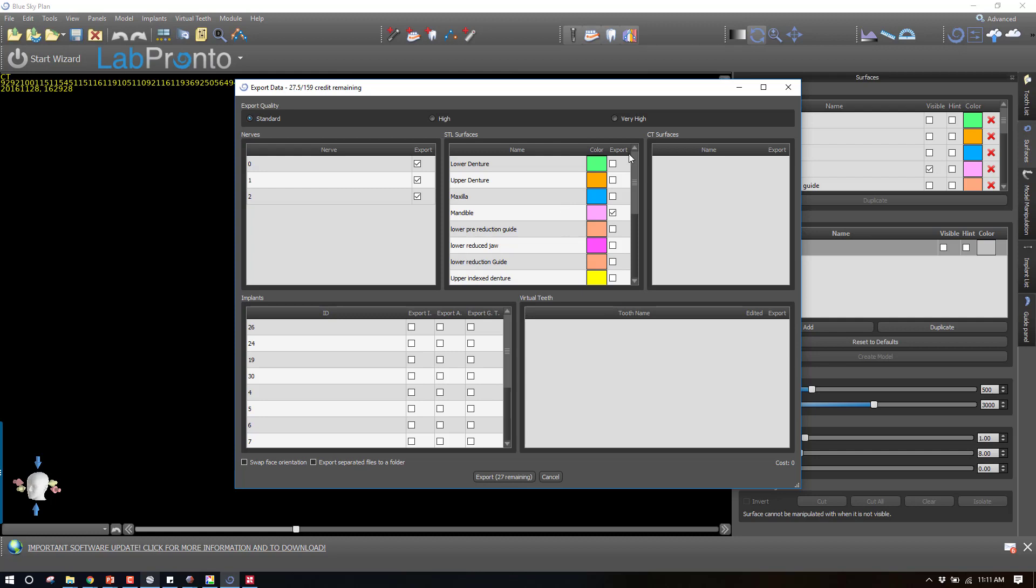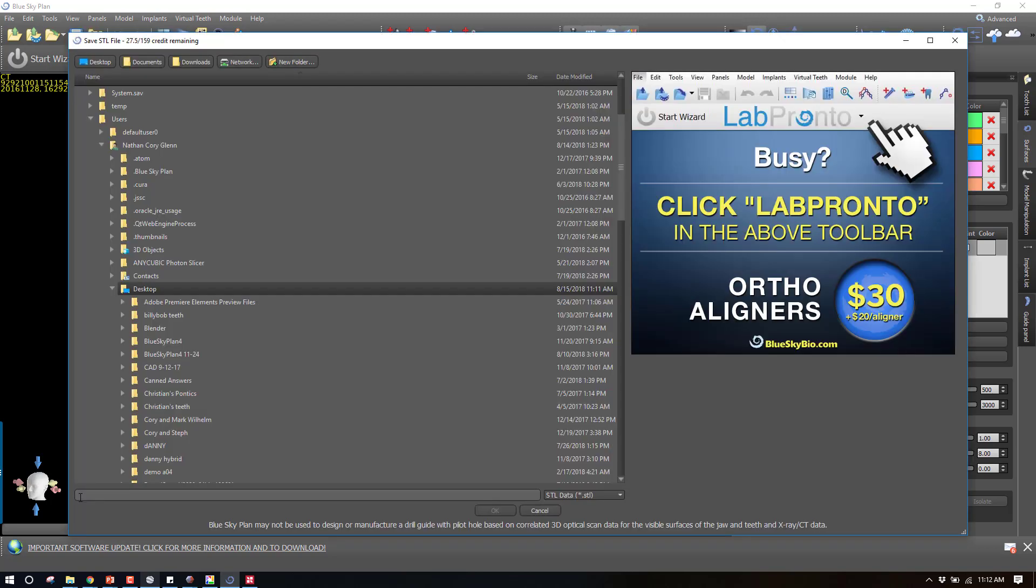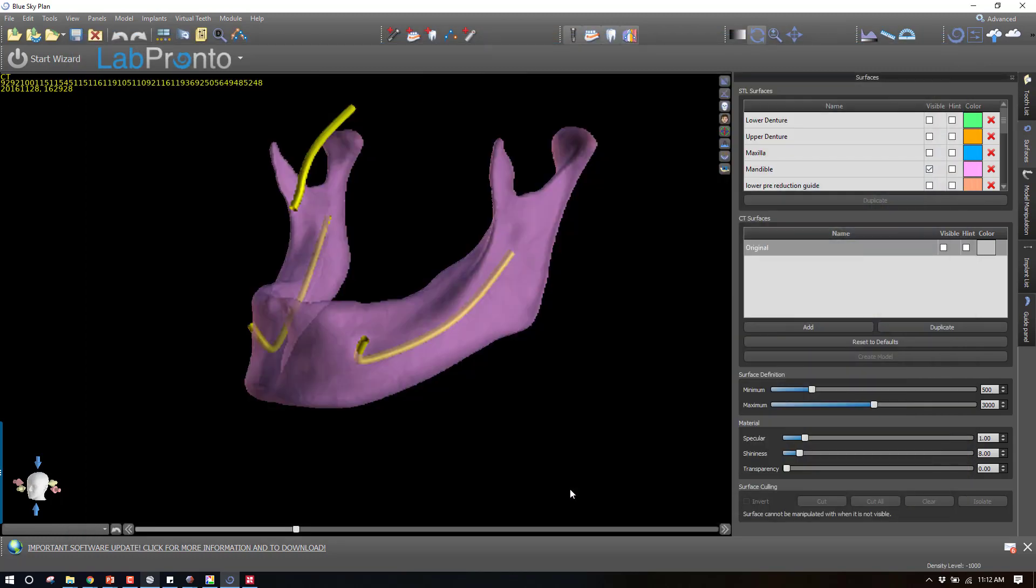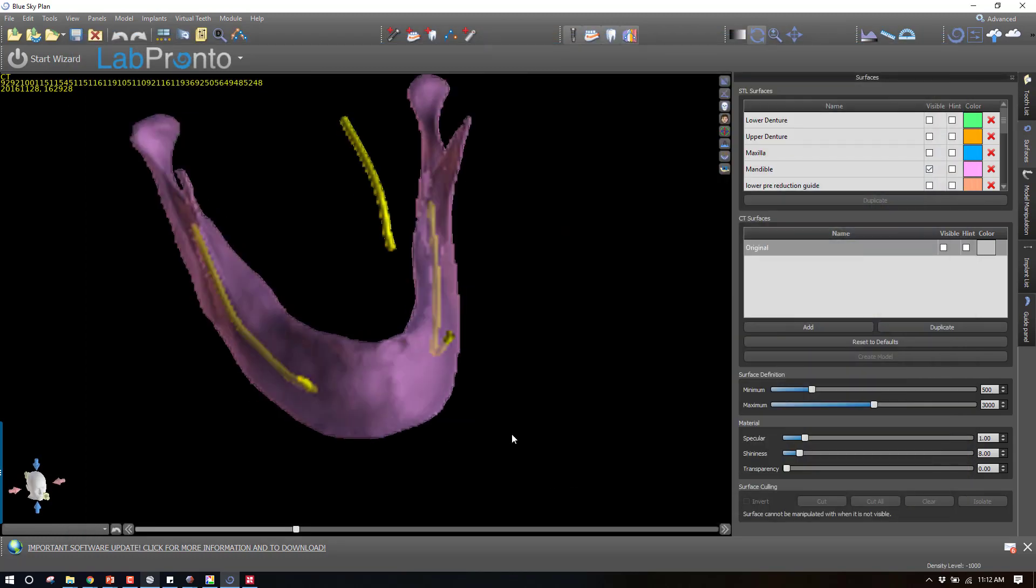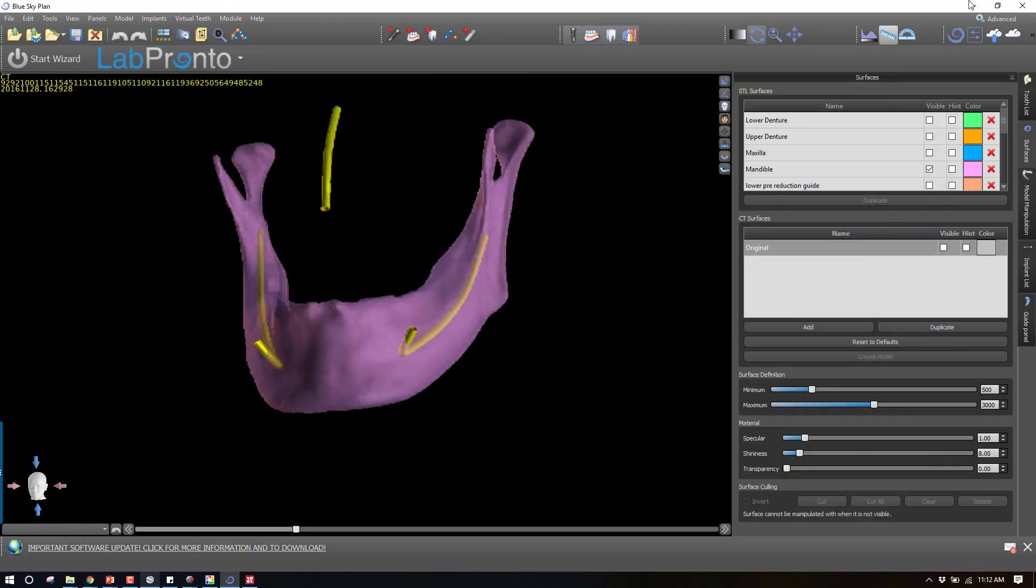Then I want to come back up and also export the nerves. This time I'll turn all of the jaw STLs off and turn off the incisive canal. So just these two mandibular nerves. We'll export those, call this nerves, save it on the desktop. Now we've got the information that we need.